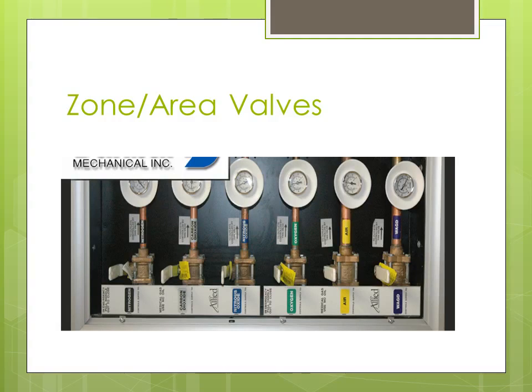So I know I've had problems with some of my older buildings where we did not exercise them, and then when we went to test them, either they were leaking very badly, and we had to have some kind of emergency shutdown to take care of it, or for that matter, in some cases, we physically could not turn them. They were just frozen in place. So it's definitely something to keep in mind about putting these on schedules and checking them and testing them with some frequency.